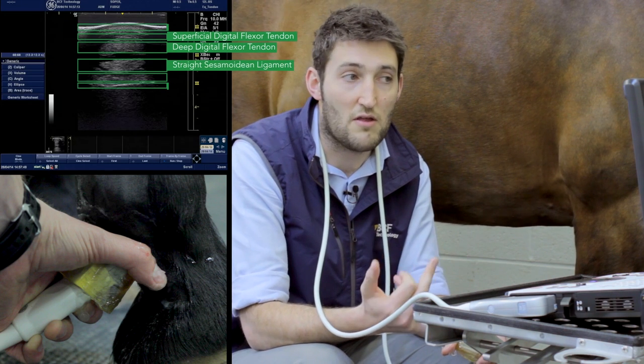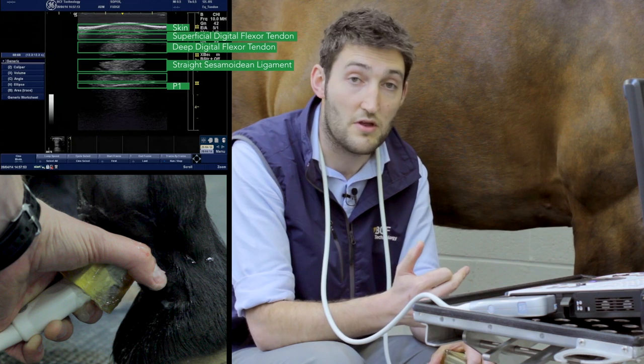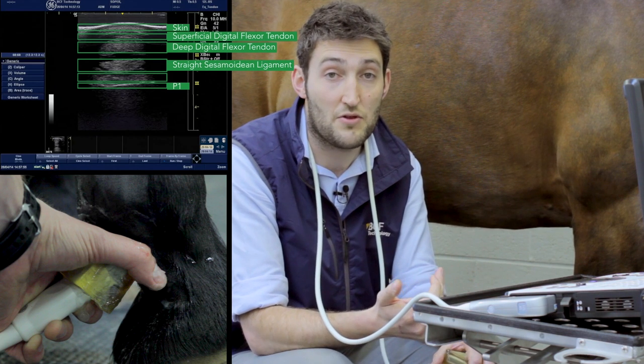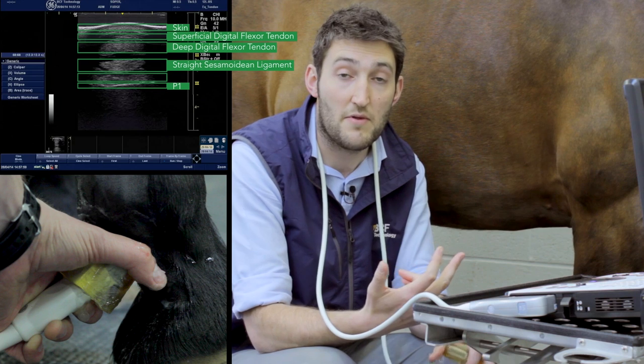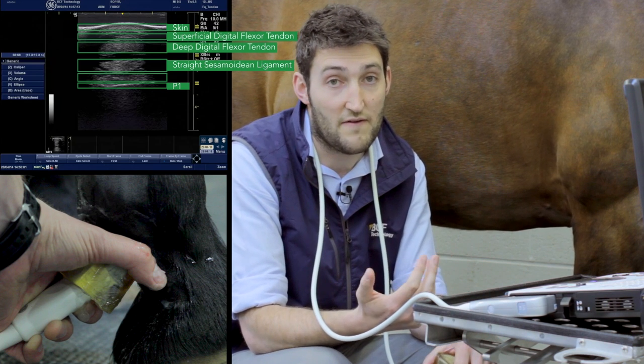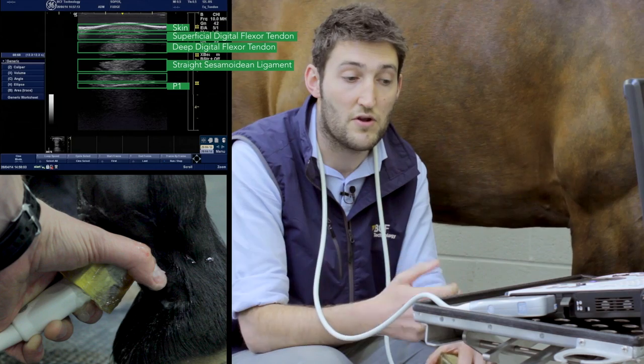It's worth noting that it's almost impossible to optimise the image for both the superficial digital flexor tendon and the deep digital flexor tendon at the same time. Here the image is optimised for the deep digital flexor tendon, but if you were assessing both structures, you'd need to take two separate images to look at both.